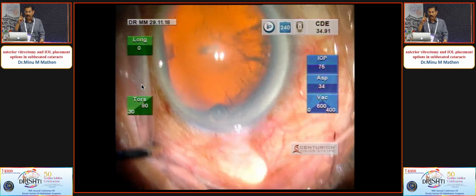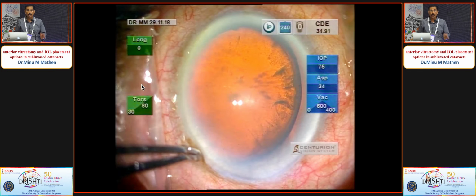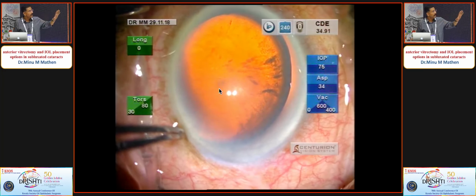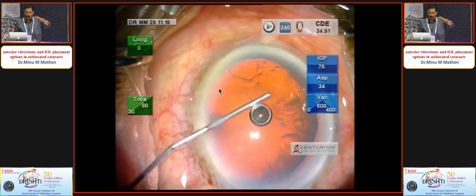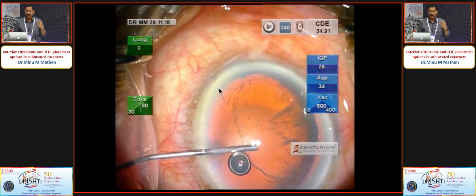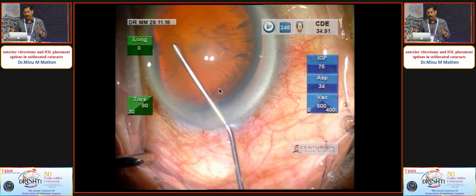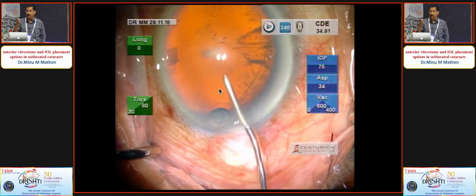So your phaco should be slow motion with low flow rate and aspiration, but still if you have Viscoat lying there plugging that area, you can see that I am putting in Viscoat from the opposite side and plugging that whole area, and after that I am comfortable doing a Rexis with the HPMC inside because the feel of the capsule is better, or I am used to it if you put in HPMC.